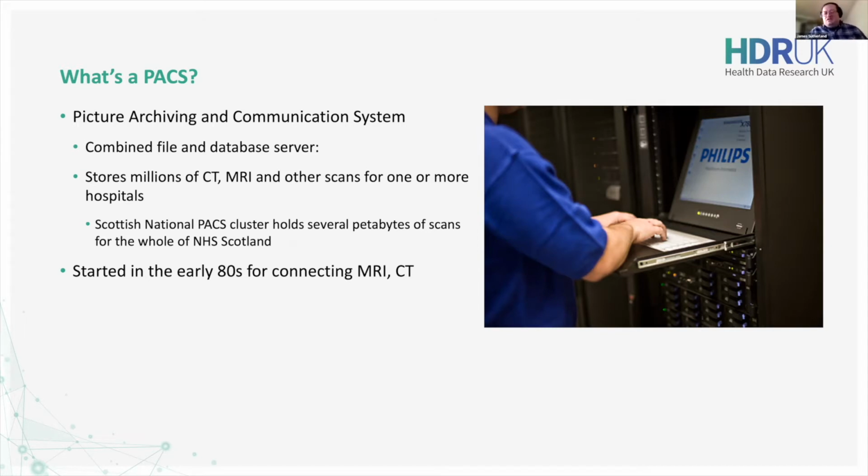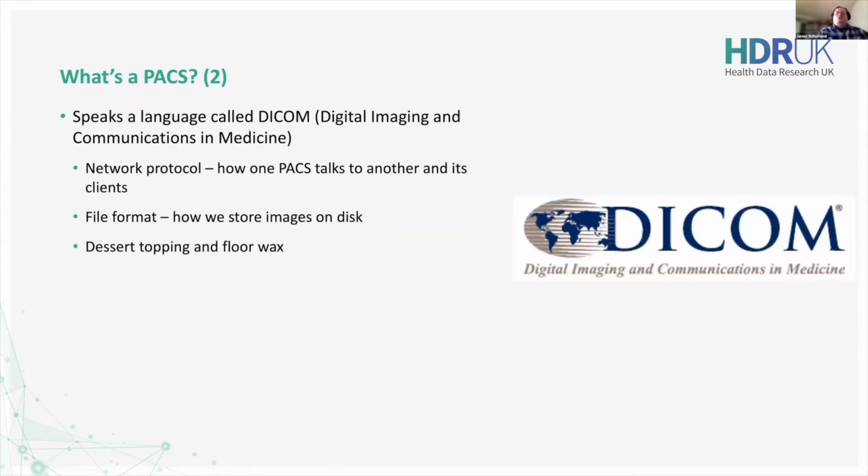Obviously, they're physically different machines and in different places, but they're doing very similar tasks, so it made sense to start grouping all that together. And so along came a standard called DICOM, the Digital Imaging and Communications in Medicine, which does all sorts of aspects of imaging. And the most relevant for us, it standardizes the network protocol, which is how PACS nodes talk to each other and how client devices talk to PACS, and the scanners themselves.